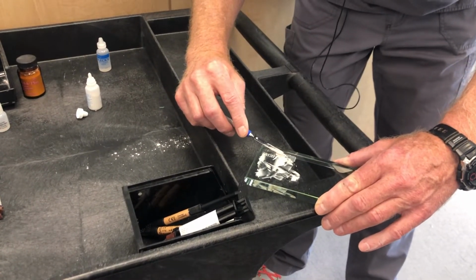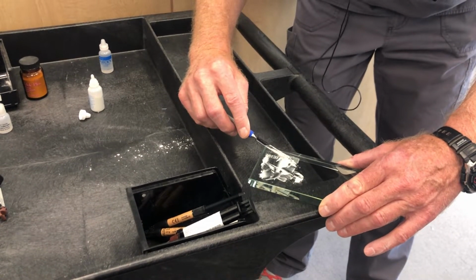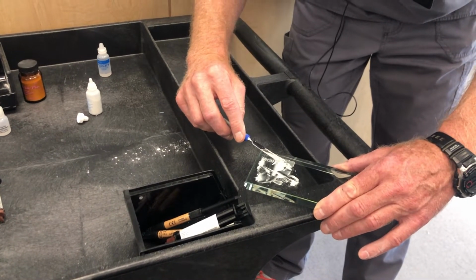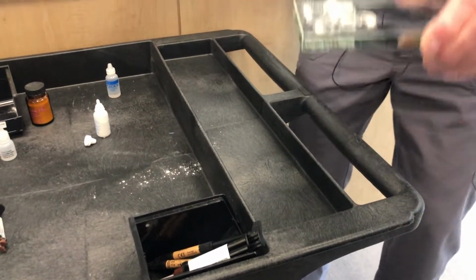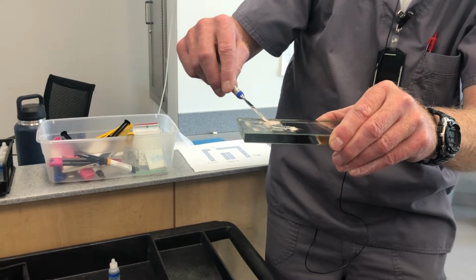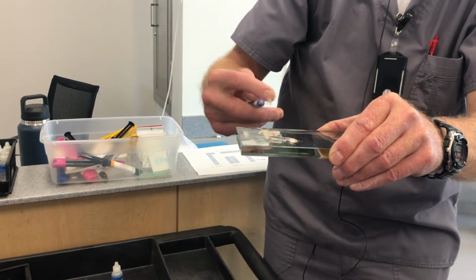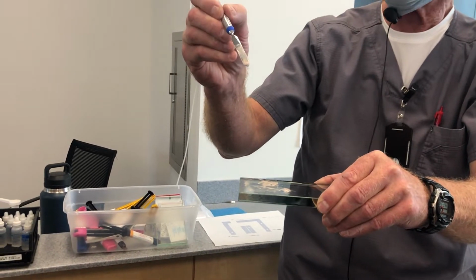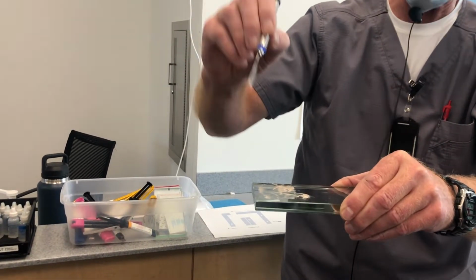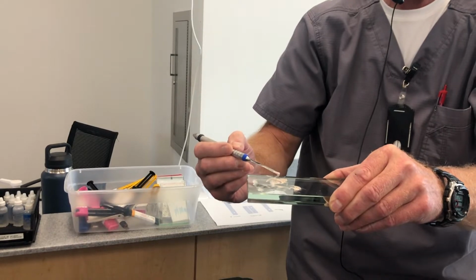Do they have Duralon at all? No, and see, that's about an inch snap off. See that? Before it snaps off. That's about an inch. So that's the right consistency now. If I was going to cement a temporary, I could take that and just go around the margins with it. Or if it was really non-retentive, I could wipe it through it and then cement it.